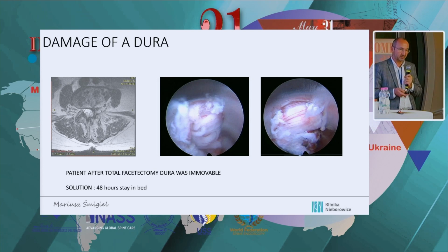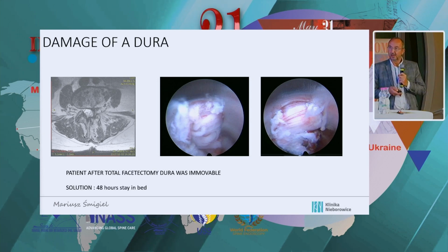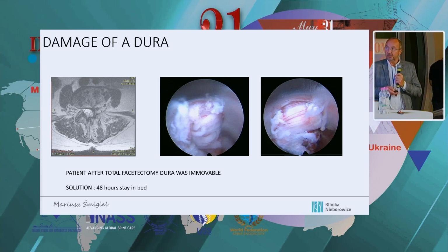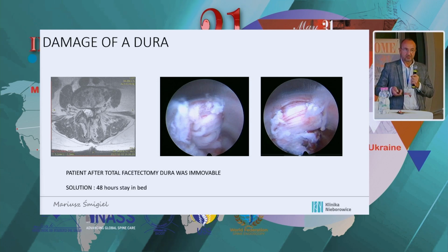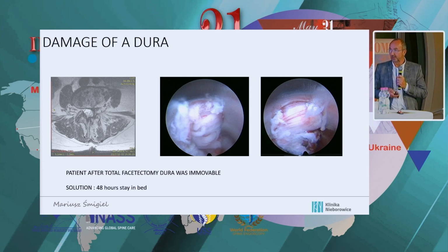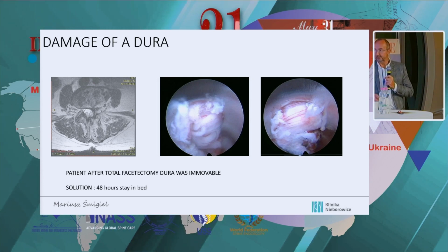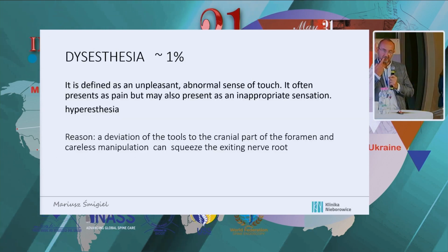Our drills we use are safe. It means that they have a blunt tip, and when we push the dura, it moves medially. But in this case, the patient was after total facetectomy, and the dura was immovable because of scar tissue. So I ordered 2 days' stay in bed, and nothing happened.